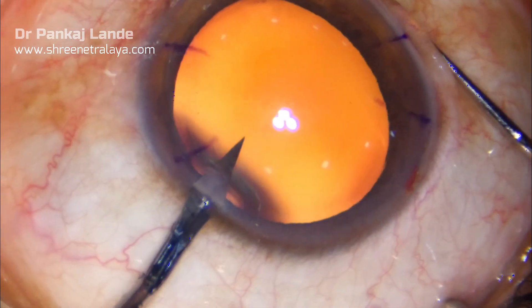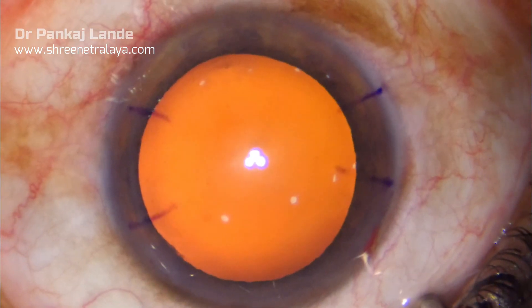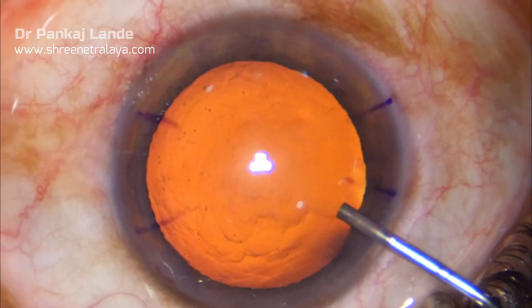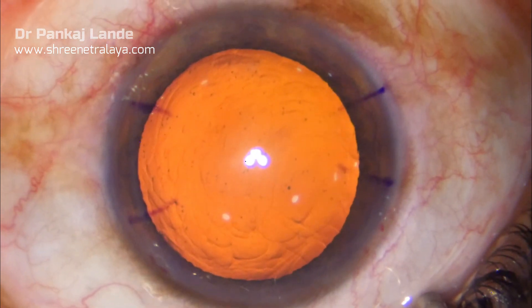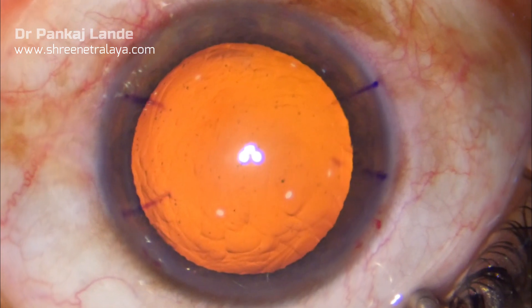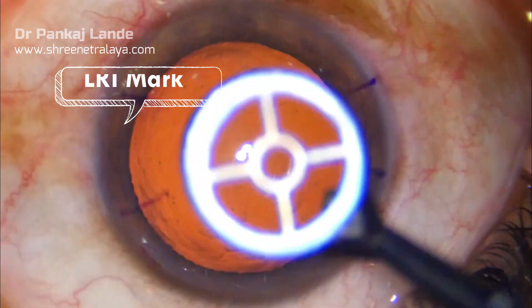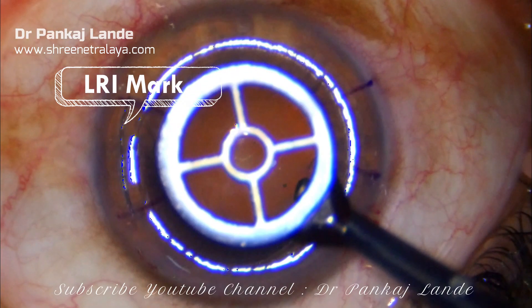My main port is a 2.6 mm incision and the side port is 23 gauge. A rexis marker is used to have an impression on the cornea. A very faint impression is enough. You can note the incision taken as I am pressing on the cornea with the rexis marker.